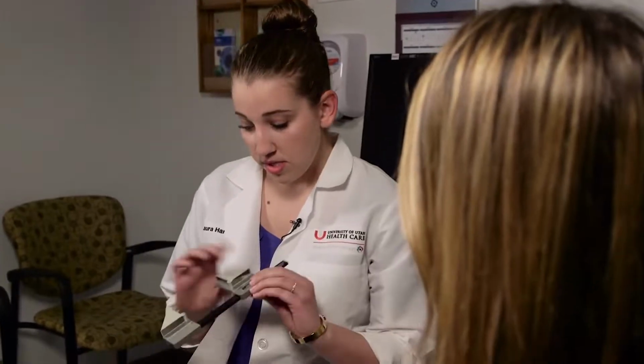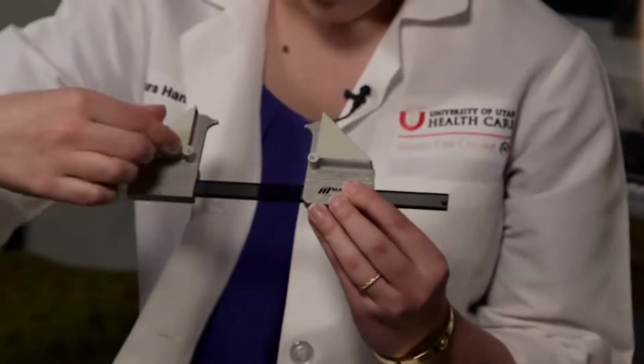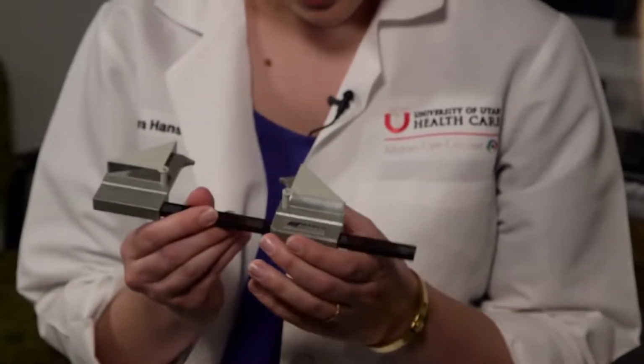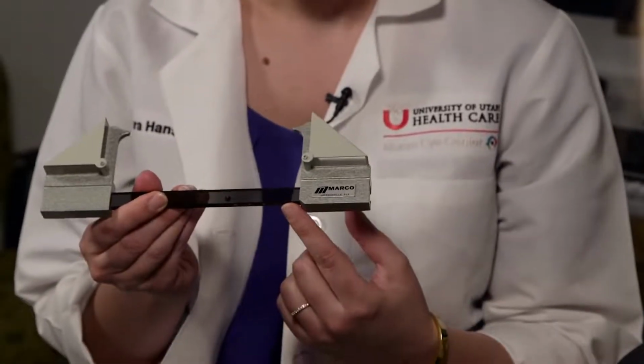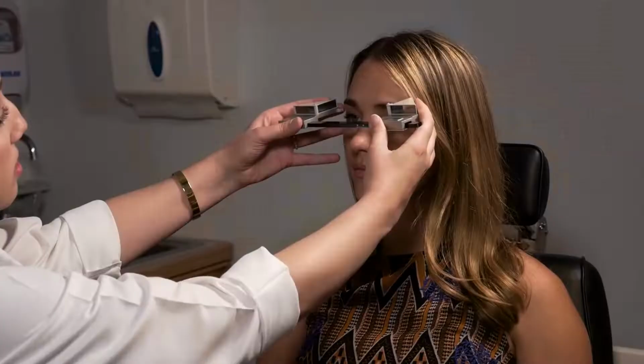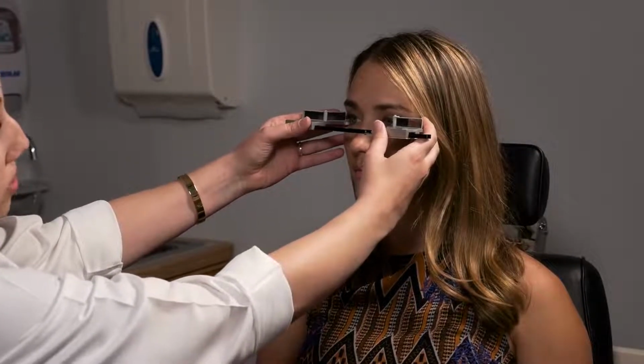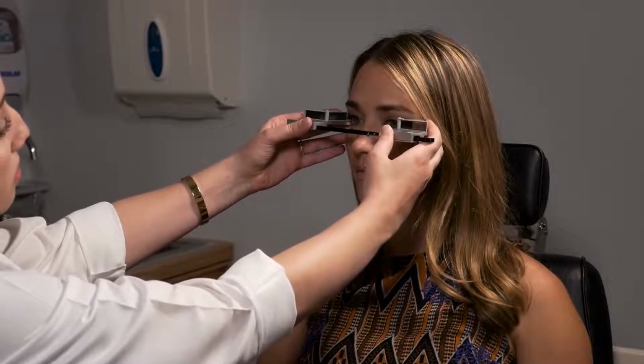Okay. I'm going to show you now how the neuro-ophthalmologists use the Hertel exophthalmometer to measure the position of the globe within the orbit. So this is the Hertel. These are the index points. These are the mirrors. And this is the ruler that you use to measure the base. So what you want to do is take the index points, and we like to put them just inside the temporal orbital rim, just slightly inferior to the lateral canthus.